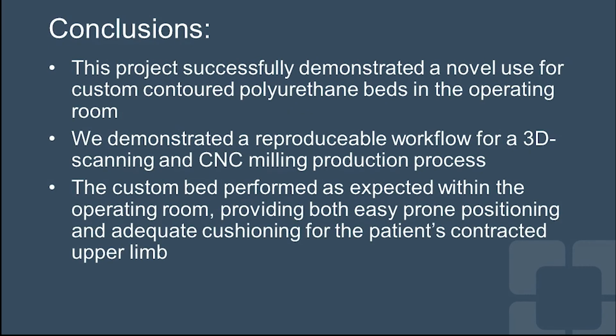In conclusion, this project demonstrated a novel use for custom contoured polyurethane beds in the operating room to assist in patient positioning, and we demonstrated a reproducible workflow for the 3D scanning and CNC milling production process. Overall, the custom bed performed successfully within the operating room, providing both easy prone positioning and adequate cushioning for the patient's contracted upper limb.